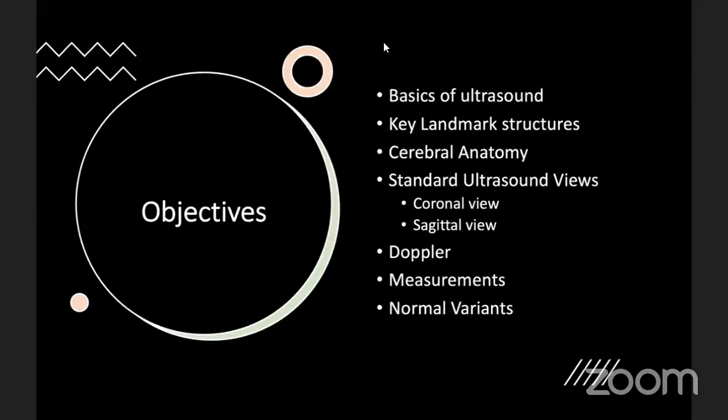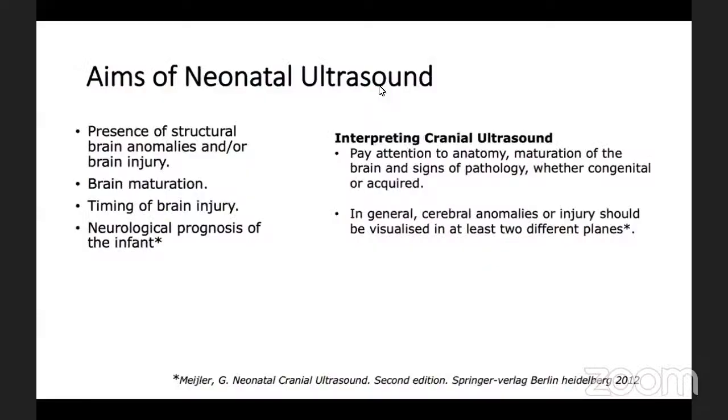So the objective of the talk today will be the basics of ultrasound; I will not go into much detail. Then we will discuss key landmark structures and cerebral anatomy, and then the standard ultrasound views, which are coronal and sagittal views. And finally, a little bit about Dopplers, measurement of ventricles, and normal variants.